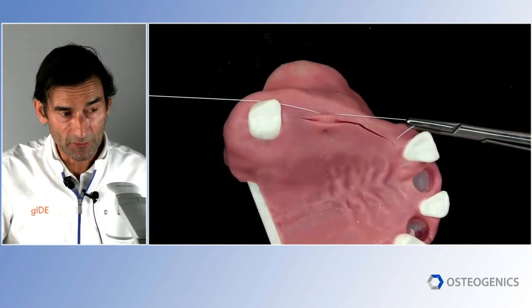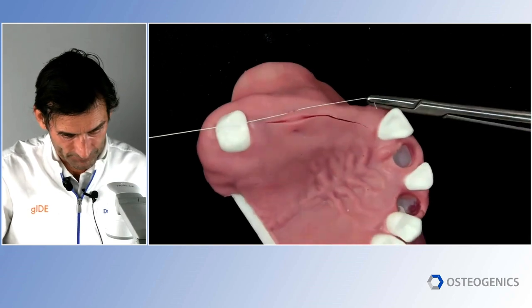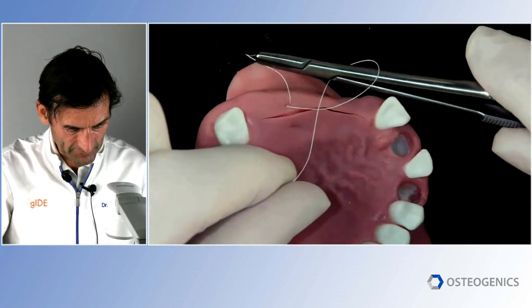So basically, when you're about 3 millimeters apical to the incision margin, you get the margin to go up 3 millimeters. So it's pretty cool. And depending on the size of the flap, you'll do multiple. And I suture this here again with 4 knots.